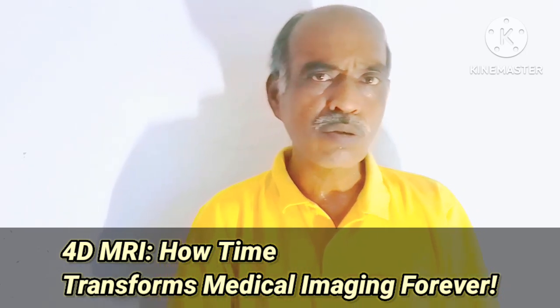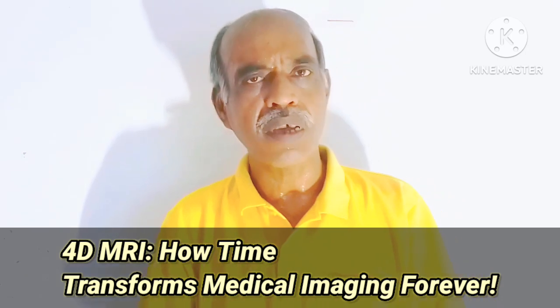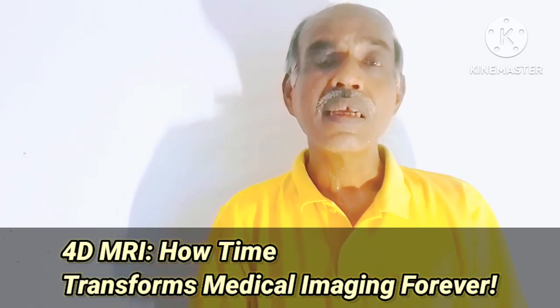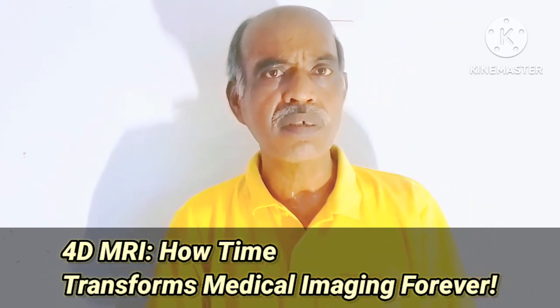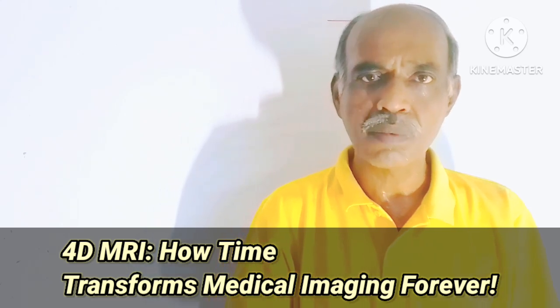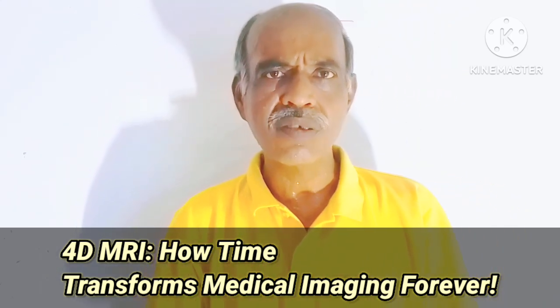When they move back to their position, they emit signals, and those signals are captured by the MRI scanner. Using those signals, reconstruction of the images becomes possible.